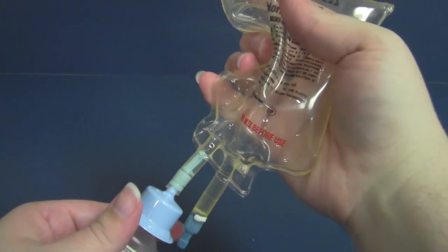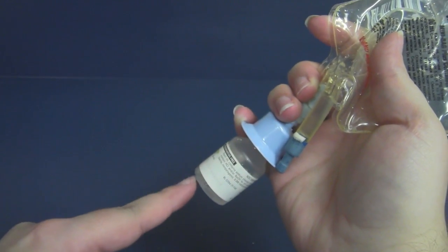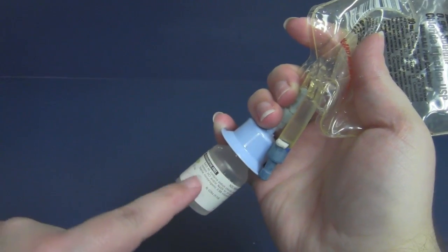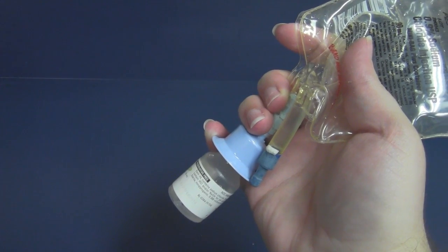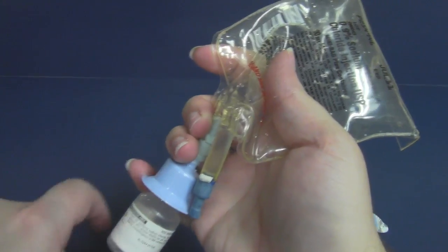And then you can squeeze the contents, the fluid from the bag, down into the vial and shake vigorously to reconstitute the medication. The antibiotics that we mix this way are notoriously difficult to get to solution, so you have to shake for quite a while.